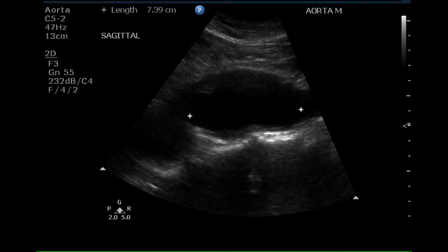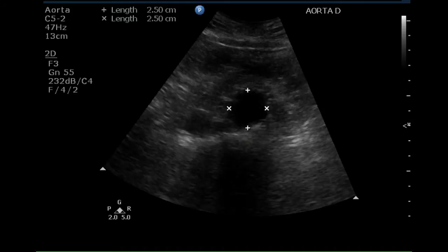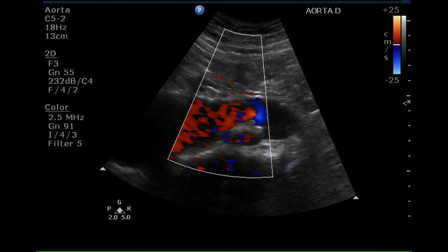The length of this aneurysm is 7.4 centimeters. The aneurysm does taper and the maximum diameter at the distal portion of the aorta is 2.5 centimeters, which is in the normal range. A color Doppler of the distal aorta demonstrates that it fills completely with moving blood.